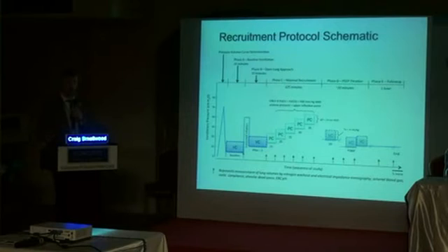And you guys know very well that there are basically two camps for lung recruitment. There's a sustained inflation, whereby you just increase the pressure to a specific amount for a specific amount of time. You've heard 30 for 30 or 40 for 40, so 40 centimeters of water for 40 seconds, or this staircase or stepwise recruitment maneuver that basically means you fix a delta pressure and then you step up the PEEP until you reach some maximum level of recruitment. And in this case, we looked at both EIT as the endpoint as well as oxygenation.